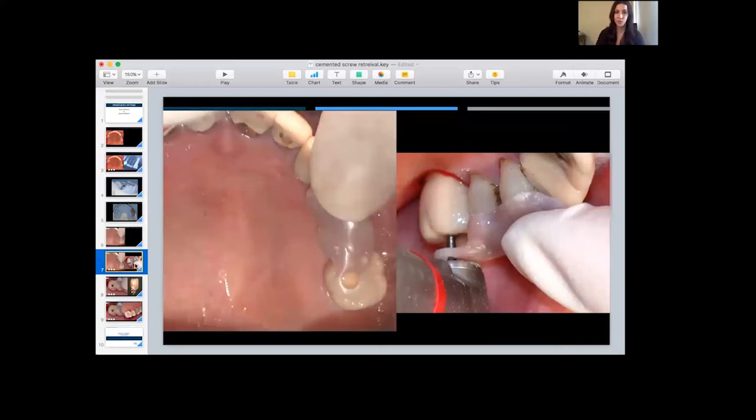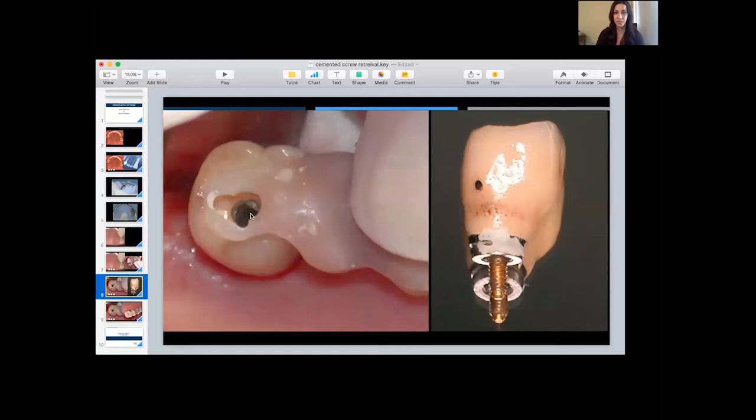Once we drill through the metal, we're successful in finding the access hole for the implant crown. You hope that the previous practitioner sealed the access hole with a soft material — cotton pellets or Teflon tape — and you strike gold when you feel your burr drop and feel a cavity there. At that point, we know that we're into the access chamber for the crown, and then we remove the cotton pellet and gain access to the screw.